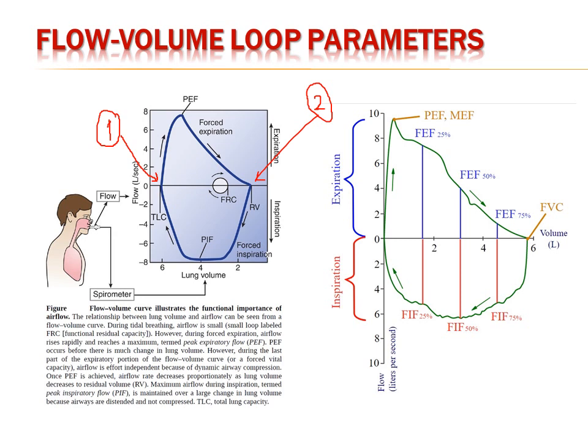And as you know from the theoretical lecture, the end of his maximal expiration means the only air volume remaining in the lung will be the residual volume. And at point 2, the patient will now take the maximal and fastest inspiration that he can take until he fills his lung to the maximum, and that will show the lower part of the curve, which represents the inspiration, and the patient will go back to the total lung capacity.